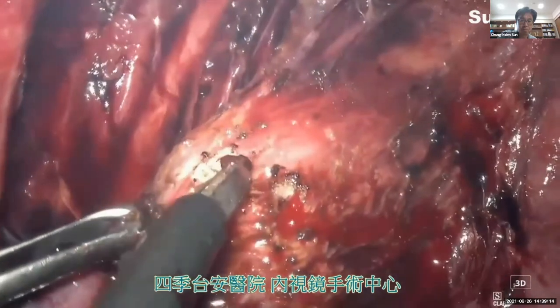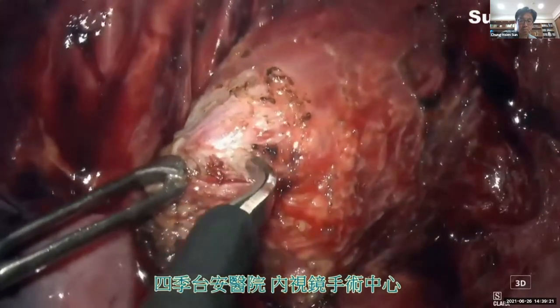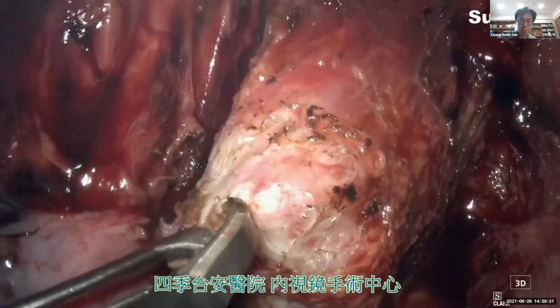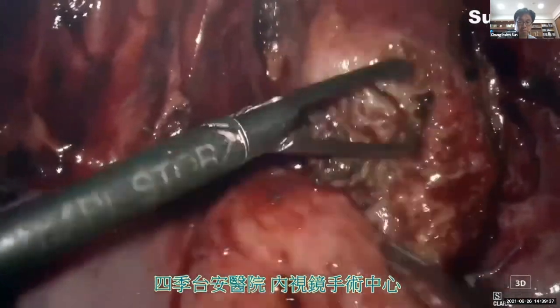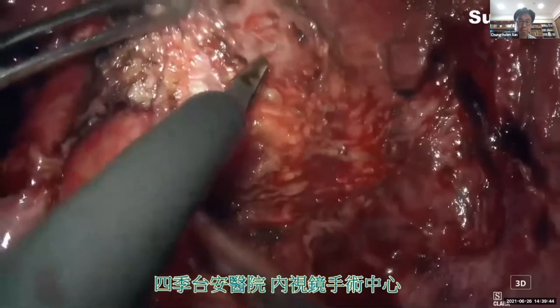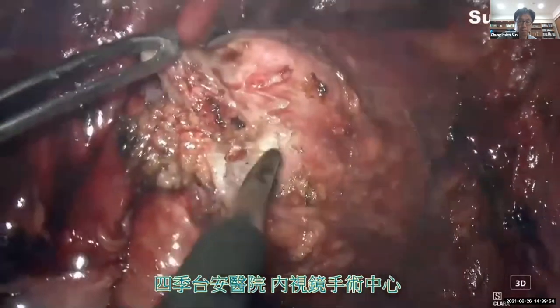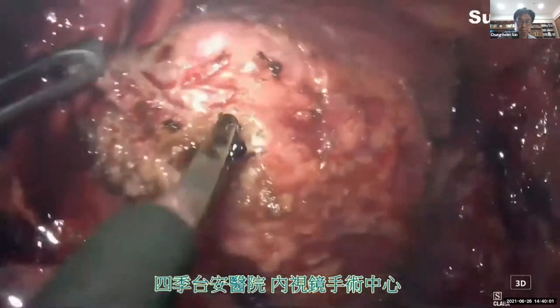I am not using any rectal probe, but as you can see, my left hand keeps the tissues on very good tension, so using the cutting current of the monopolar, I can quickly differentiate between the lesions and the normal tissue. Now you can see the system is also very important to keep the tissues on tension. So by traction, counter traction, it will be easier to differentiate between the normal tissues and the fibrotic DIE nodule. You can see some chocolate content from the DIE nodule.